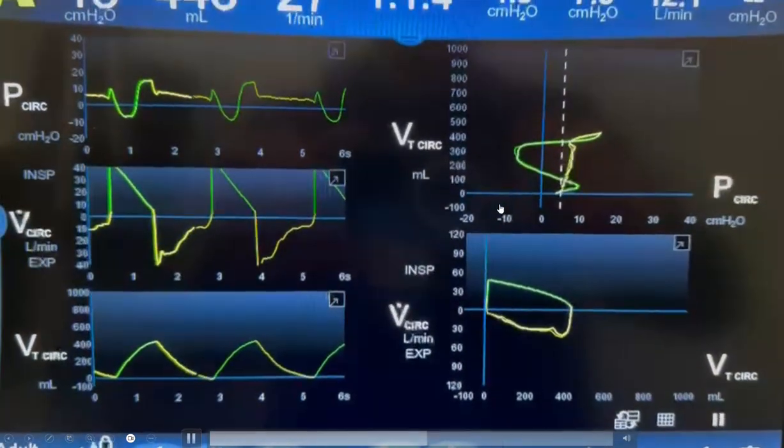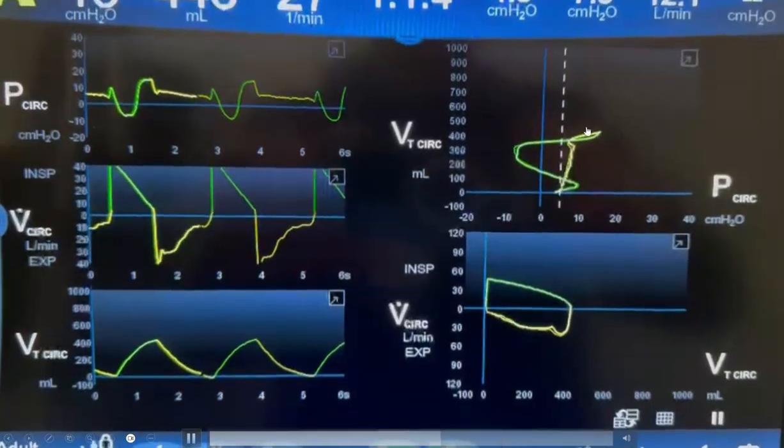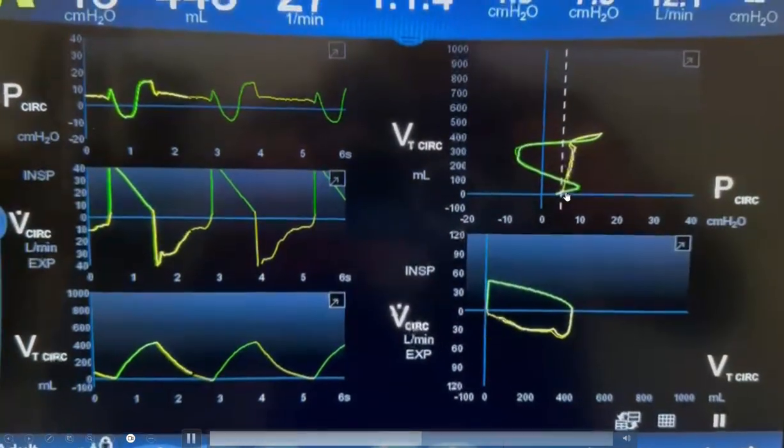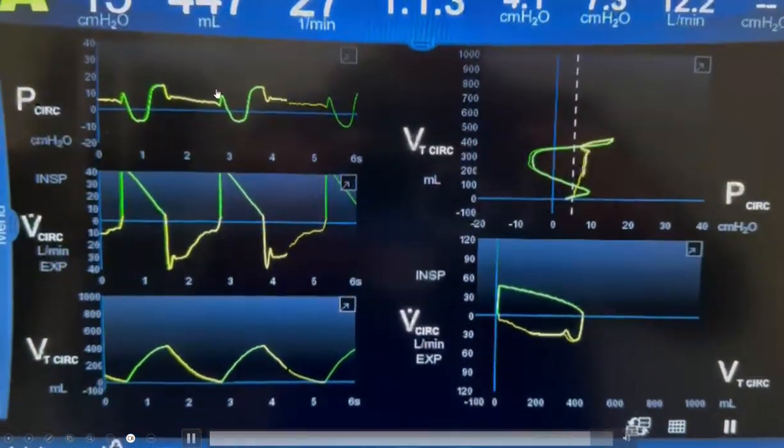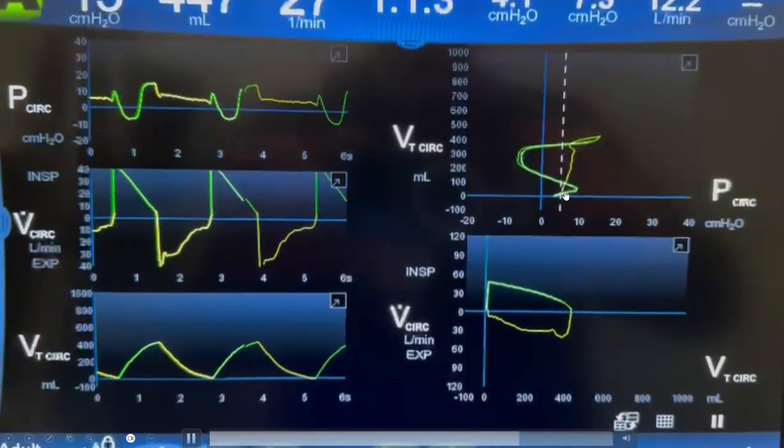You can see the same thing on the volume-pressure loop. Let's trace it: green is inspiration, yellow is expiration. You can see the drop in the pressure initially from the PEEP level to that negative deflection here.